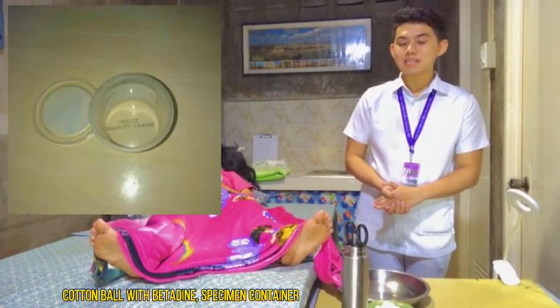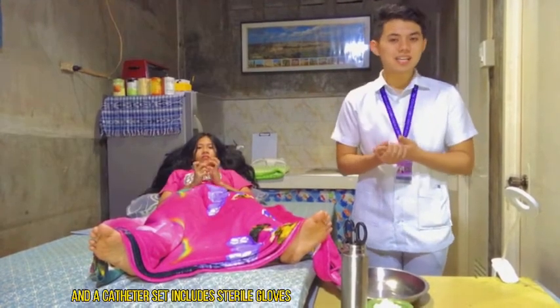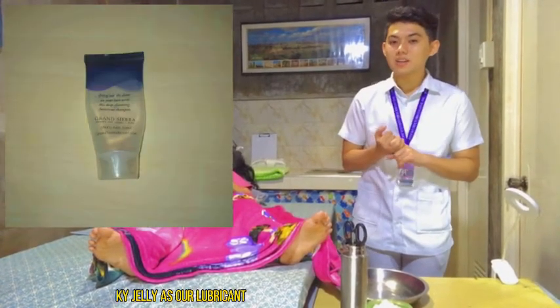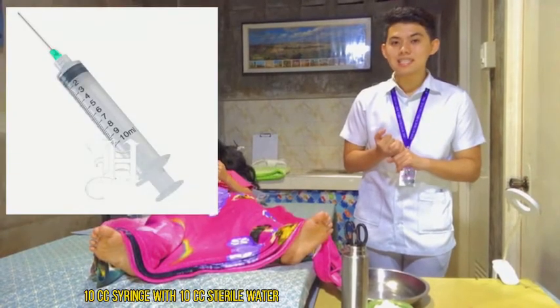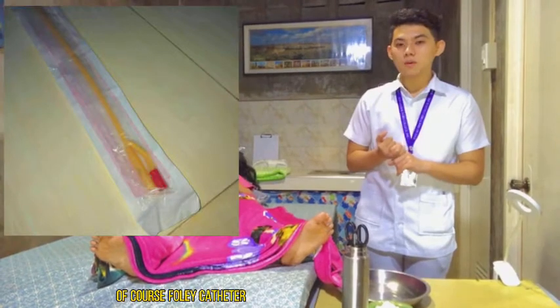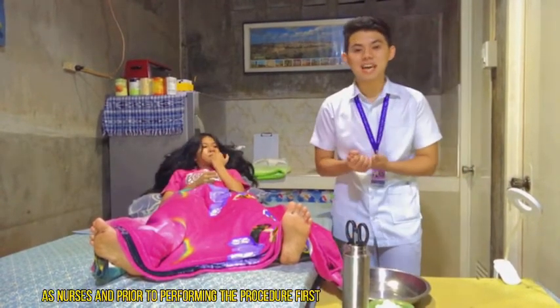betadine, specimen container, catheter sets, and a catheter set includes sterile gloves, absorbent pad and eye sheets, KY jelly as our lubricants, 10cc syringe with 10cc sterile water, of course Foley catheter, urine bag, and catheter tape. Completeness and organization of our equipment ensures our efficiency as nurses.